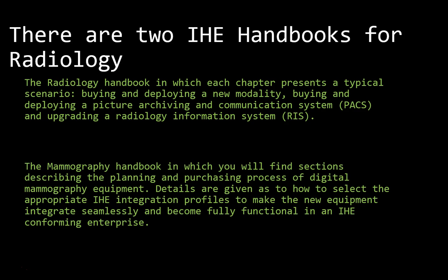The principles outlined in each scenario can be applied to any systems acquisition and deployment project that involves integration of systems with IHE-defined transactions. Each scenario includes advice for those selecting and purchasing new systems and for the technical staff who will handle the installation and configuration of the new system.